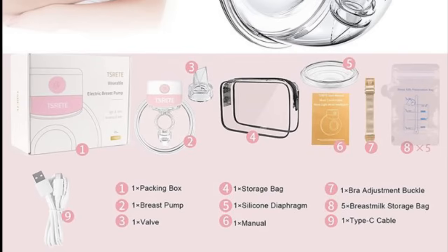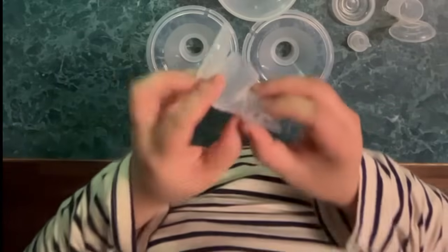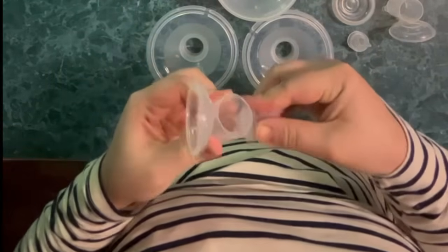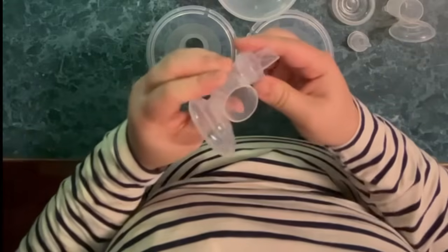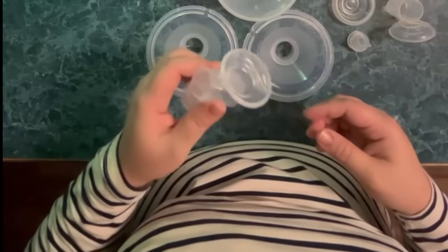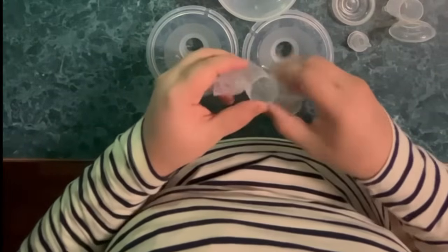Let's now assemble the breast pump. The silicone diaphragm is the first one to be assembled, but here I am first installing the valve into the bottom of the linker, making sure it's installed in the correct direction. And I'll do the same onto the other breast pump.